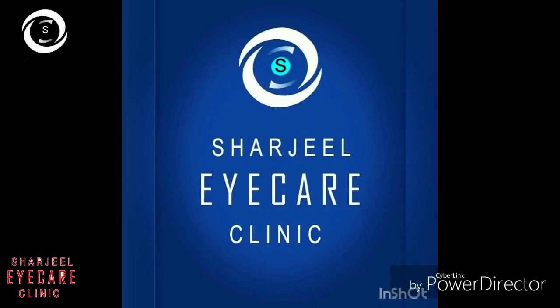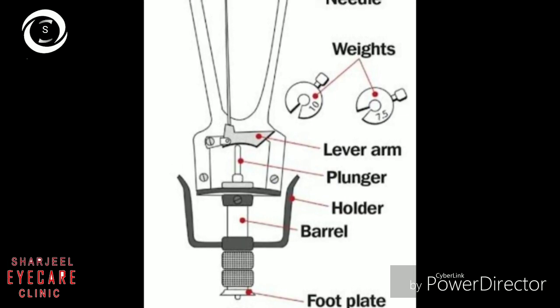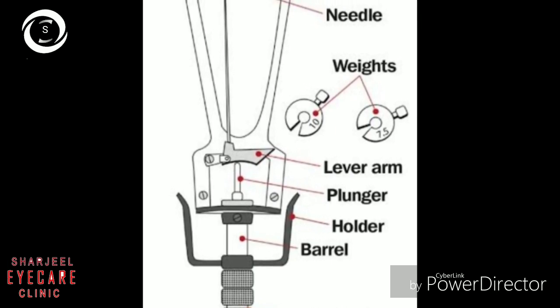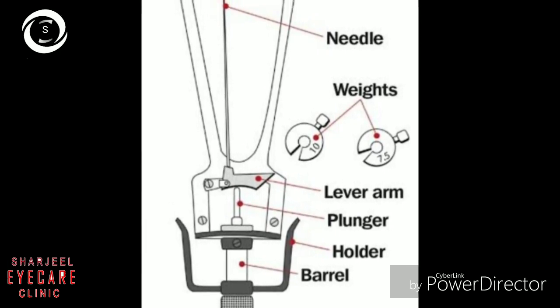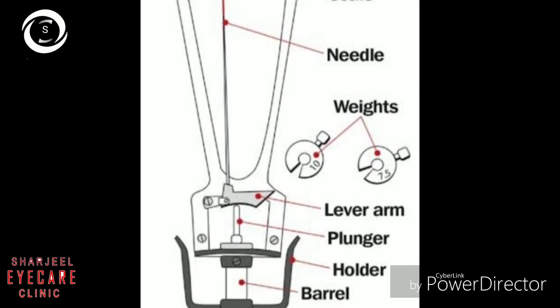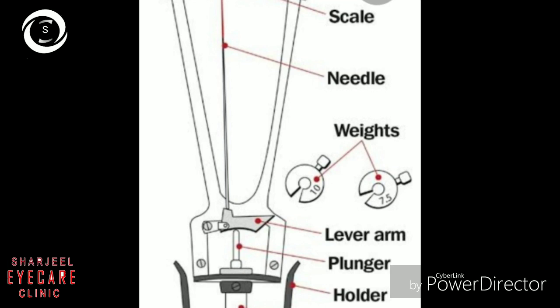In this video we will demonstrate indentation tonometry. The Schiotz indentation tonometer is shown. It has a foot plate, the barrel holder with which you hold it, a plunger where you put weights, a lever arm, weights of 7.5 and 10 grams, a needle, and a scale.